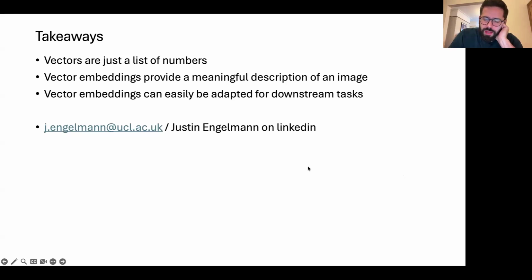Justin, thank you for that. I was just wondering, have any of you experimented with reducing the size of the embedding space that you used in the masked autoencoder in RETFound? In our group, we just use conventional autoencoders to represent images for genetic analysis and stuff. And even when you encode images with 256 or 128 embeddings, you still have quite a lot of redundant ones, even when it's small retinal images.